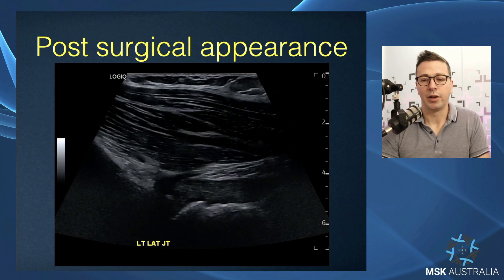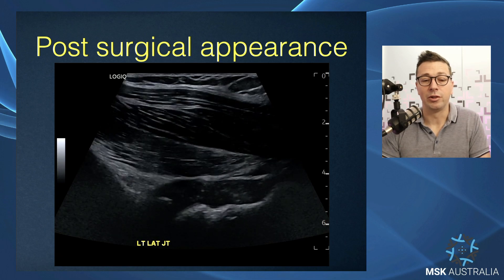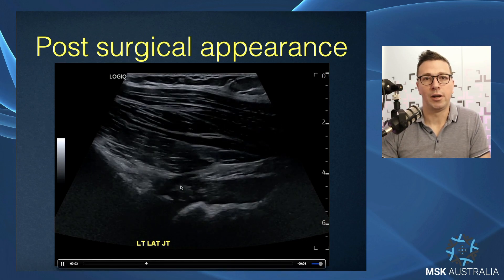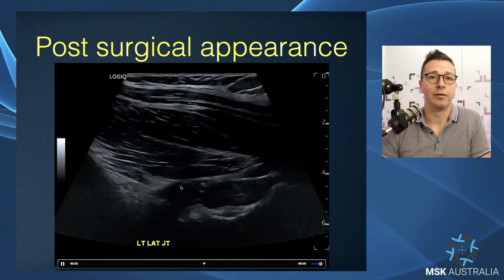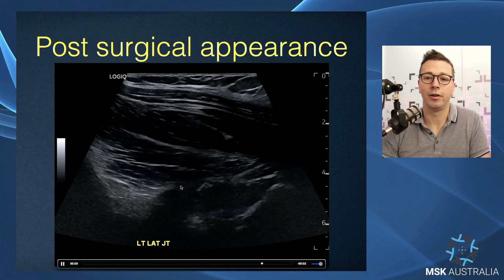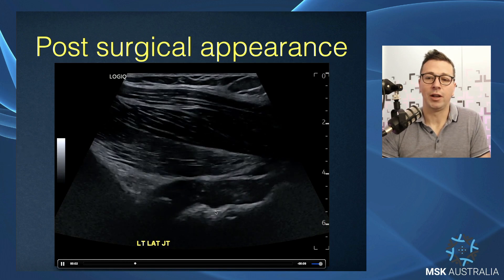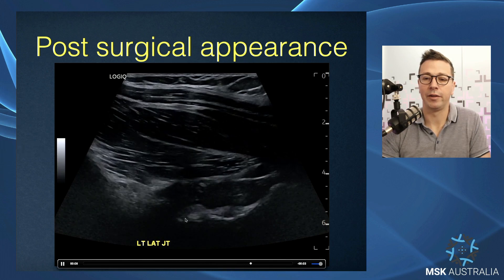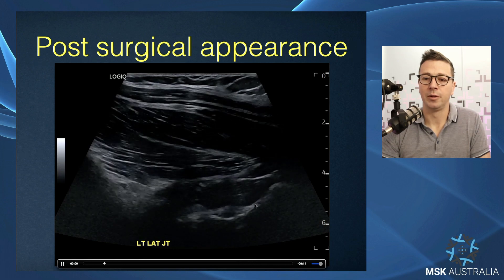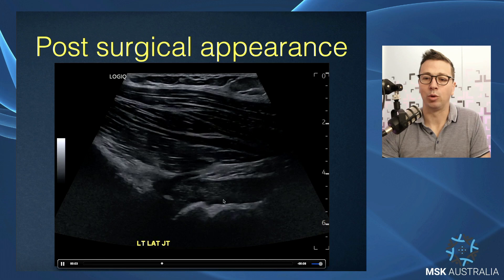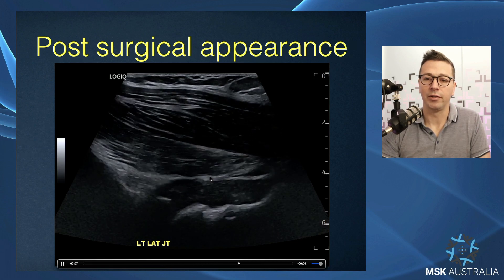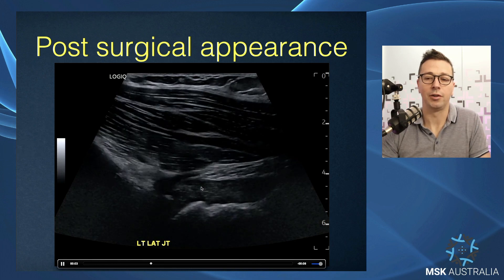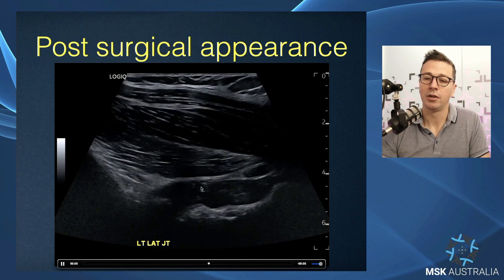With cam resection — for a young patient with a cam deformity and FAI who has not yet developed osteoarthritis — they may go in and resect that additional component of bone. Sonographically, we see the acetabulum and femoral head where they've scalloped out that cam component of the femoral head-neck junction, making it more concave. We can also see that they've incised through the lateral hip joint capsule, with suture material visible — a capsular closure has been performed.